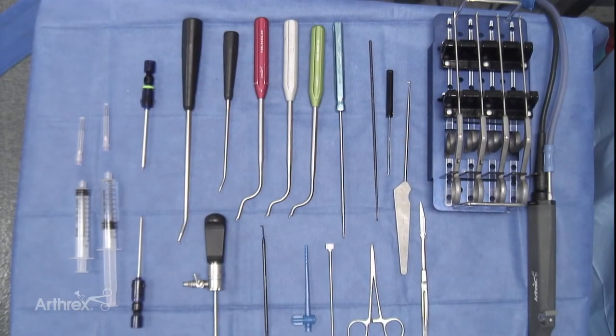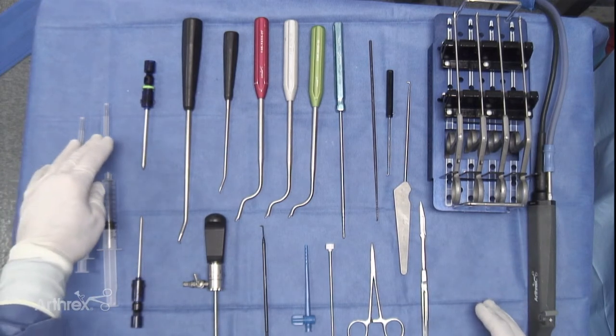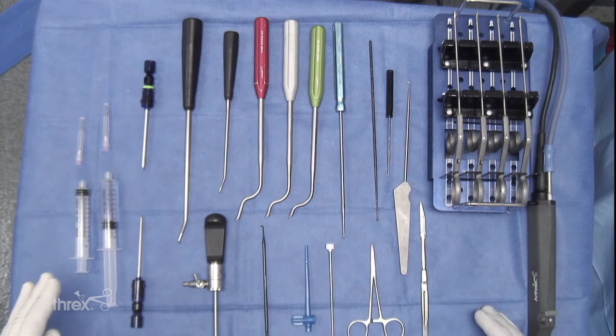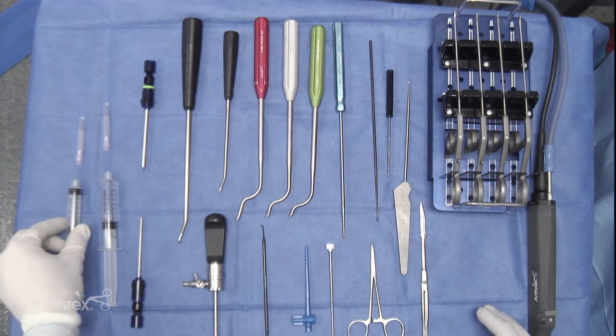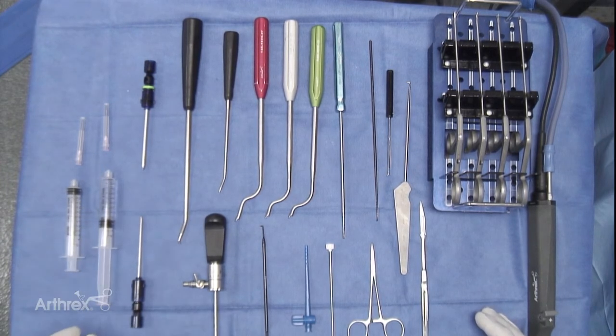Prior to commencing stifle arthroscopy, it is important that the surgical table is organized and the equipment needed is present and well set up. As you can see from the table below, we have 18 gauge needles, which are required to allow both arthrocentesis and distension of the joint. A sterile empty syringe to collect joint fluid, and a syringe with saline to distend the joint.